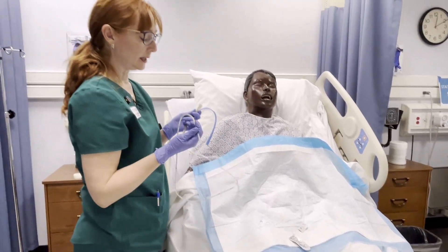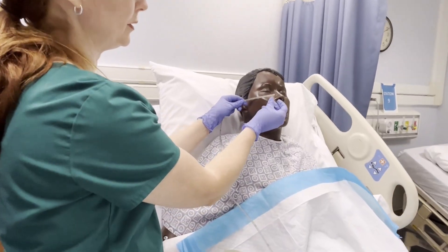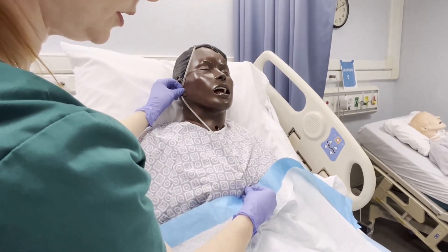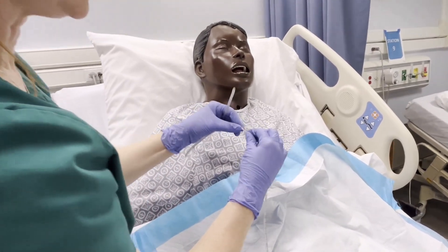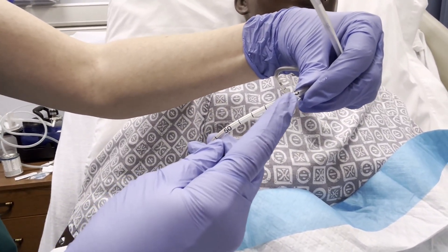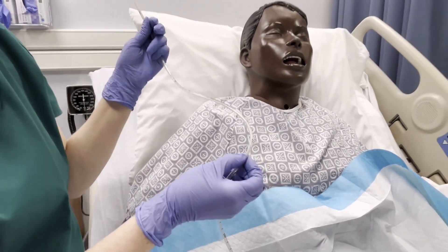You want to know approximately how far in the tube needs to go. What we do is measure from the nose to the ear to the xiphoid process, which is just where the ribs come together. Looking at this particular tube, the marks are between the 45 and the 50, so that's about where it will exit the patient. Then I'll know it's down into the stomach.